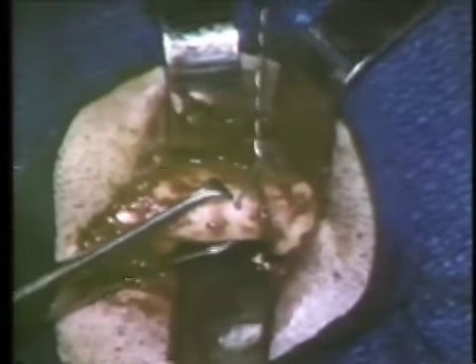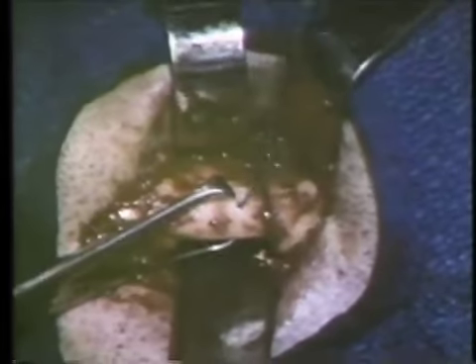And we'll soon be in a position where the segment can be fitted into its goal position. Wire is temporary again and not finally secured, but we do know that this segment's going up as well as back.